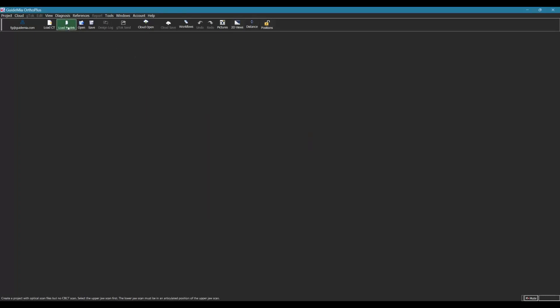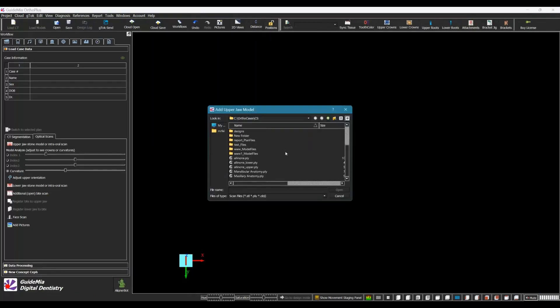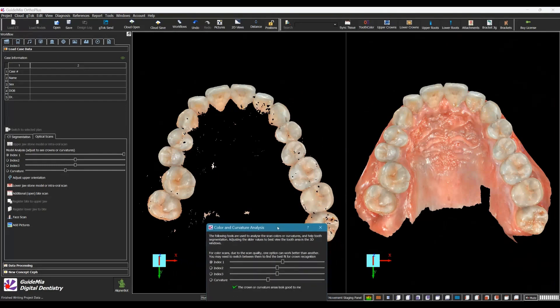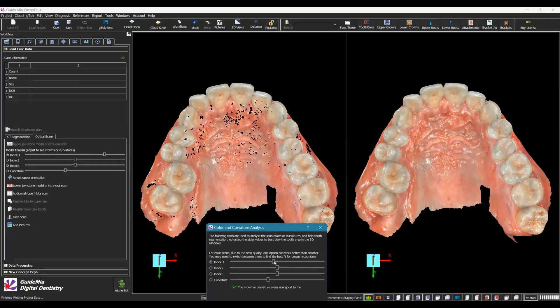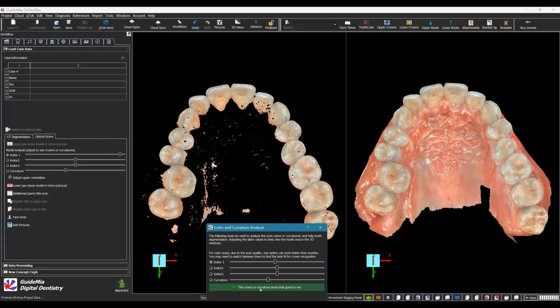We can start by creating a project with optical scan files but no CBCT scan. Select the upper jaw scan first — the lower jaw scan must be in an articulated position relative to the upper jaw scan. Perform color or curvature analysis for the model. There are three indices values used to analyze colors. After adjusting the color index slider or curvature slider to obtain the best segmented area of the crowns, click the button to continue.